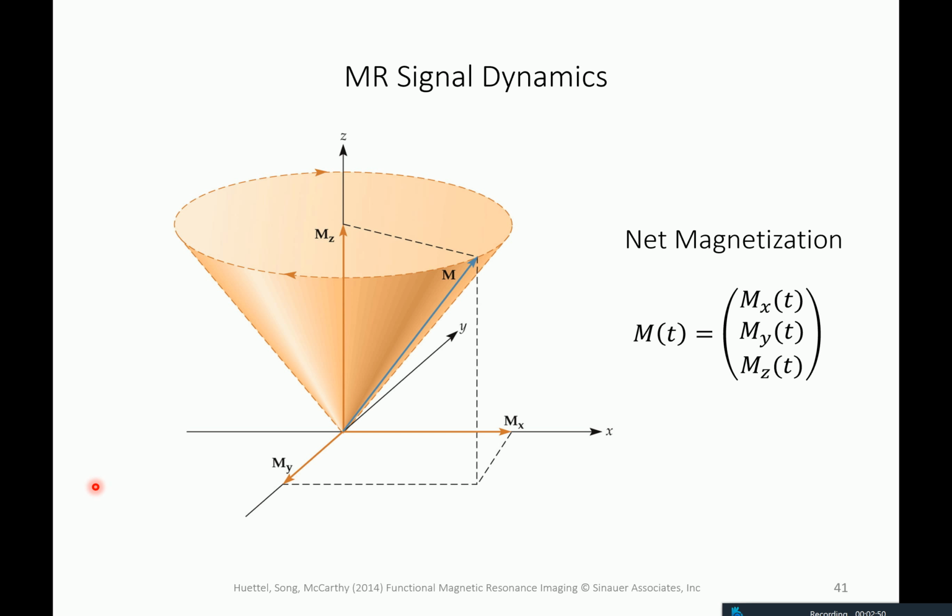So we talked about that, and then we also discussed that it's interesting to look at the aggregate net magnetization of a whole sample, and this is what is shown here on the slide. So the typical level of description, from an fMRI perspective for a single voxel, or from an old school nuclear magnetic resonance viewpoint just for a sample, is this.